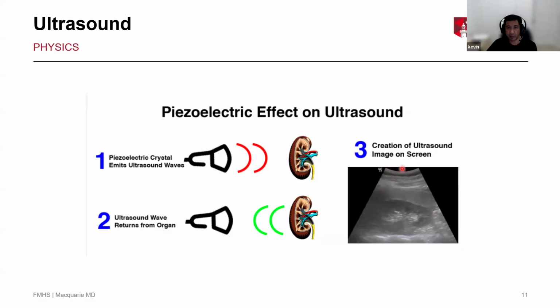This transducer is up here. The sound waves project down onto the tissue, and they reflect off the different surfaces, and the clever electronics reconstructs a cross-sectional image. Ultrasound is fantastic because it gives you real-time imaging of the organs you're looking at. The problem is it doesn't give you a whole three-dimensional stack of images. It's only selected images, and it really depends on the operator to see the pathology and diagnose it.